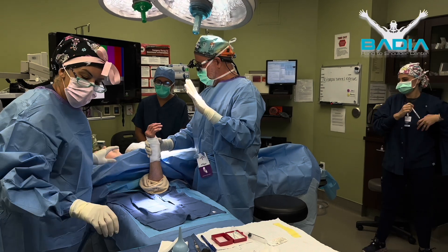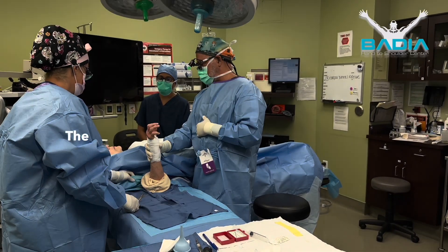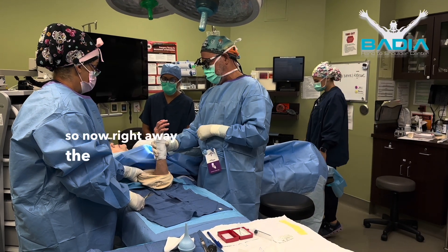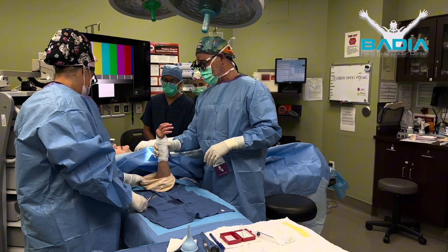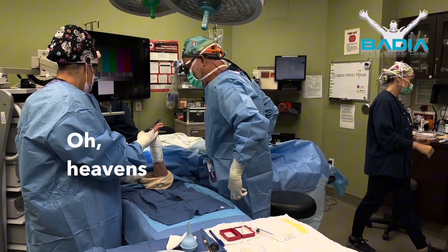Why don't you open your right hand for me all the way? Make a fist. Excellent. See, the beauty of not having sedation — you can do that right away. And the best part is you can eat whatever you want. What do you guys eat from Georgia? You're going to eat some grits and some happy stuff.